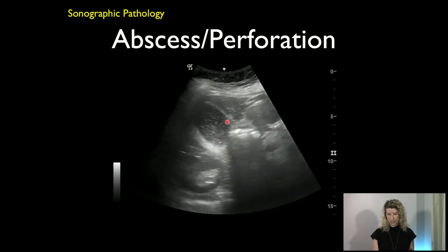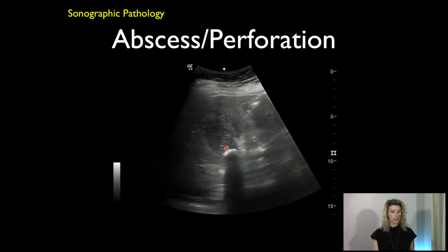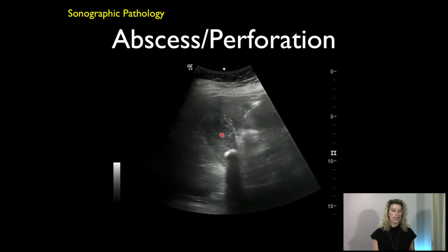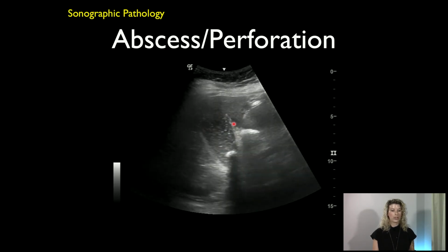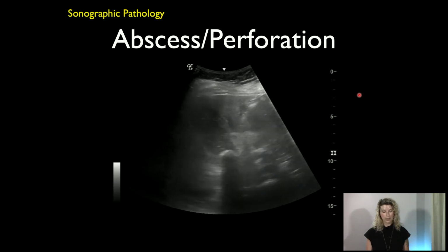Here what you're seeing is a large gallbladder that looks full of all kinds of garbage, and then you see a giant stone here at the bottom, right? So this was a patient, and you see pericholecystic fluid. So this is a patient that had acute cholecystitis, probably waited a little too long for some medical attention, and the gallbladder turned into a large pus-filled structure.